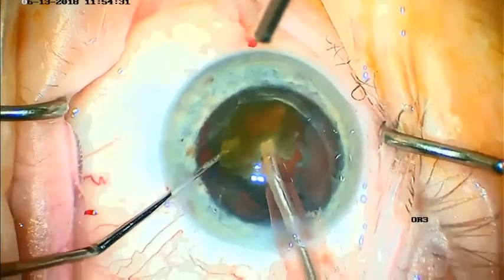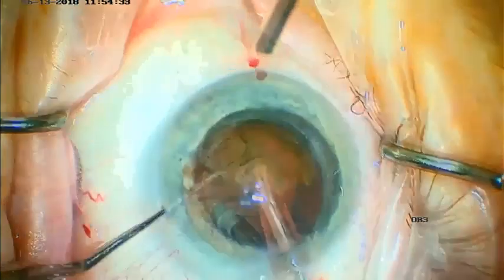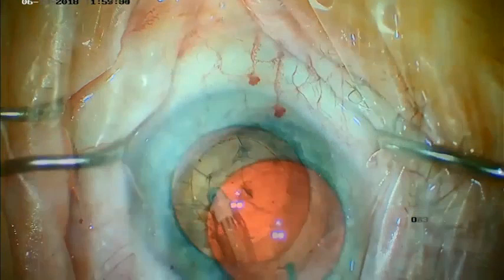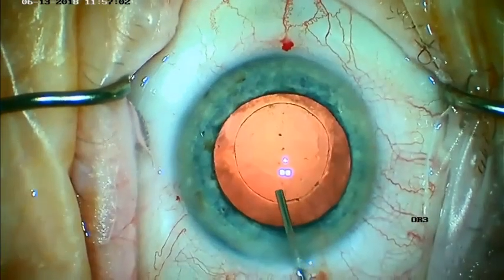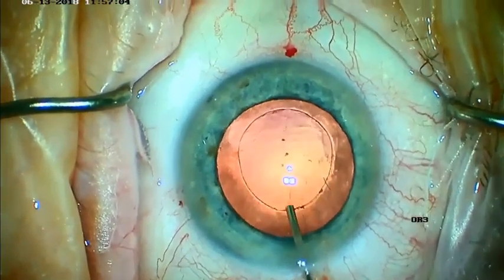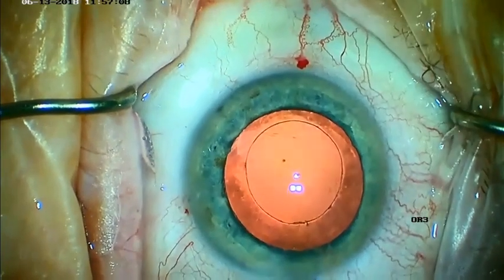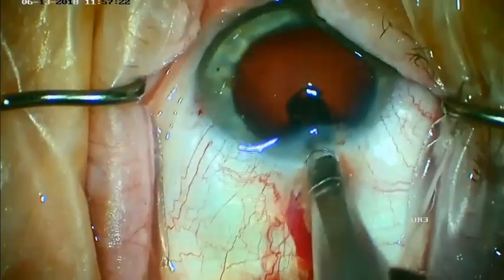Phacoemulsification proceeds quite uneventfully, benefiting from the nice strong capsulotomy, and cortical removal is fairly routine. We then inject some viscoelastic, typically cohesive, and the intraocular lens is folded and placed through the 2.2 millimeter incision.